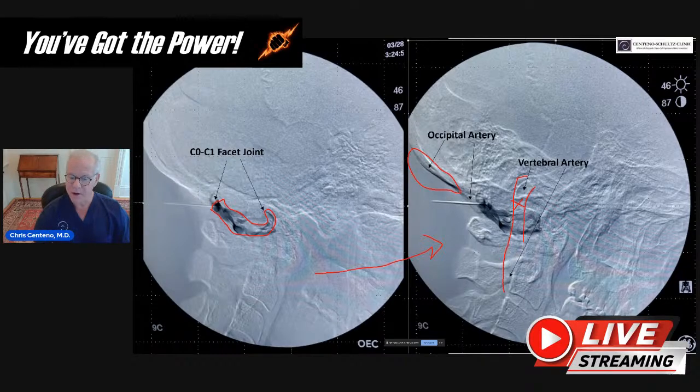and realize that that artery also lives right below me here. We're looking at a 2D picture. So bottom line is I see that there's something else going on. I abandoned this level. We were injecting other things in this patient, so it wasn't that big a deal because it's not safe to inject there. So that allows me, obviously, to prevent a very serious complication in that patient.